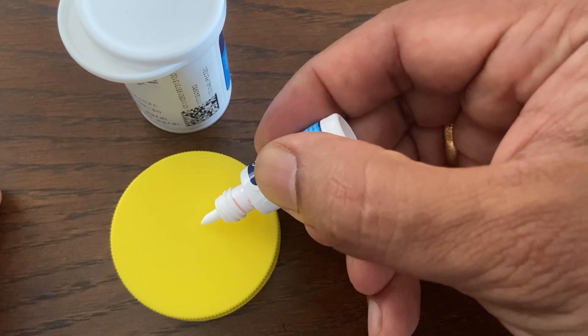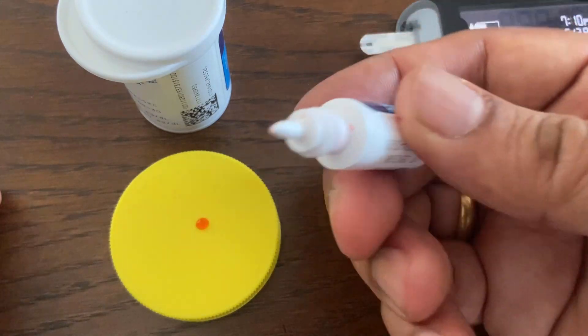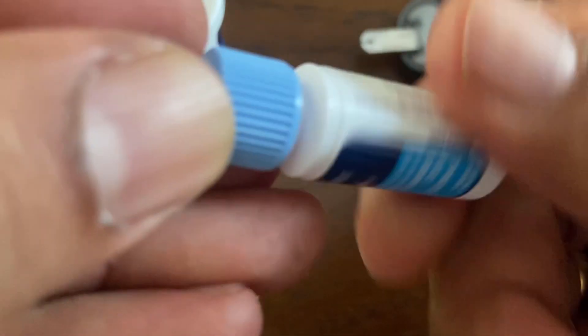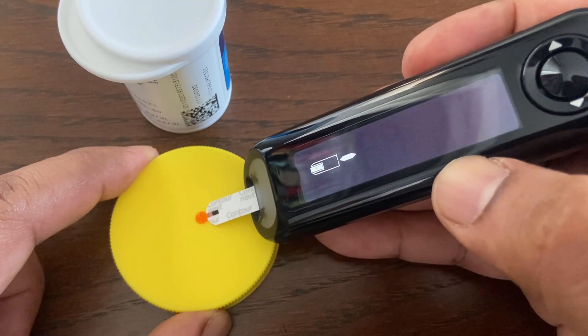Next, squeeze a small drop of solution onto a clean, non-absorbent surface. Immediately touch the tip of the test strip to the drop of control solution. Hold the tip in the drop until the meter beeps.